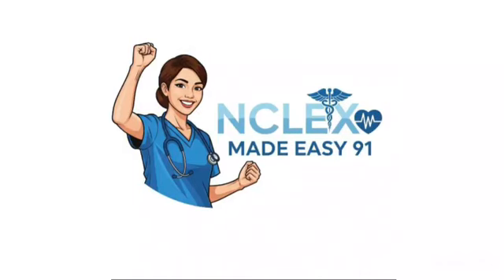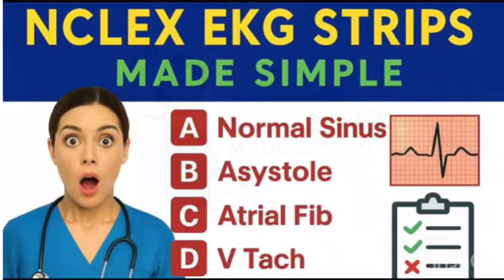EKG strips can feel overwhelming, but what if I told you that in just 5 minutes, you could break them down so easily that even the trickiest rhythms start making sense? In this video, I'm going to show you the simple step-by-step method to master EKG interpretation the NCLEX way. Stick with me till the very end, because I'll also share insider strategies that top students use to avoid mistakes and pick the right answer every time. By the end, you'll feel confident, fast, and ready to crush those cardiac questions on test day.